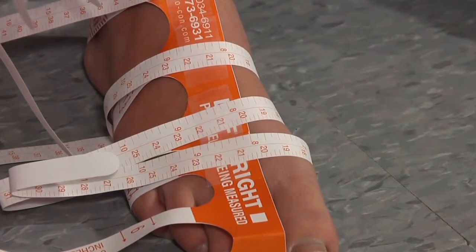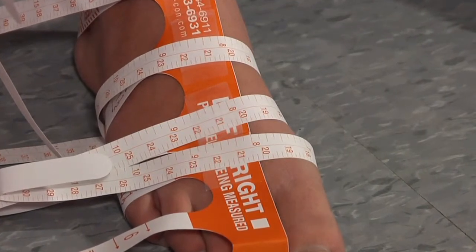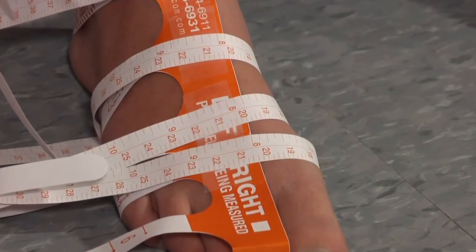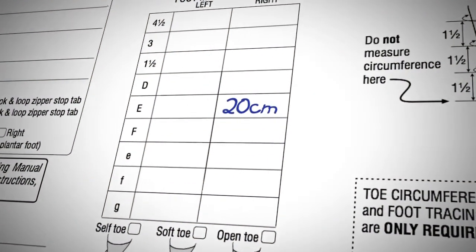Read the outside edge of the spine of the tape to determine circumference measurements. Measurements are displayed in inches on the left-hand side of the tape and centimeters on the right. Indicate on the form which measurement system you are using.